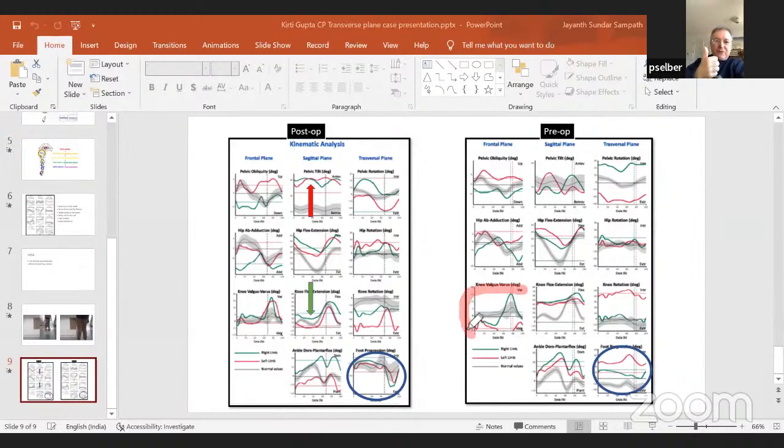You know, is femoral torsion matching what we're seeing in kinematics? And if it's not, we need to be able to understand at this point in time, with all this technology, why is it not? Is it because the patient has a triplegic dystonia and this dystonia is confounding everything? Is it because the marker placement is telling us that the coronal plane is in a different position?